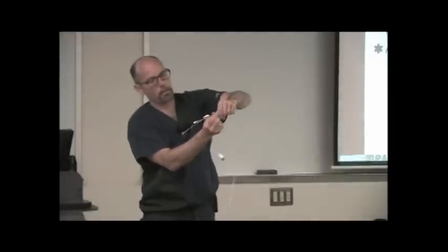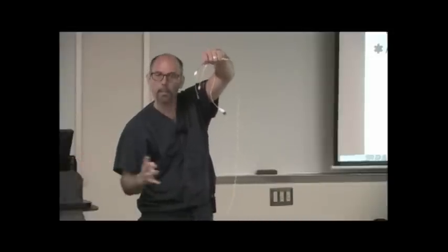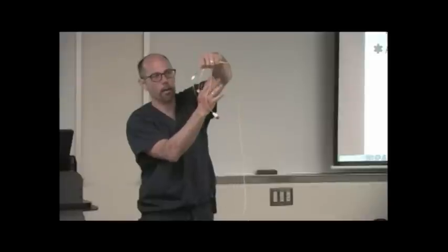it has 3 lumens on it, and this is one type of Swan-Ganz catheter. There are about 4 or 5 different kinds. This is the most common, the most generic of the Swan-Ganz catheters. It has 3 infusion lumens on it, and they're labeled. The blue one is labeled proximal. This one is labeled medial, and this yellow one is labeled distal.